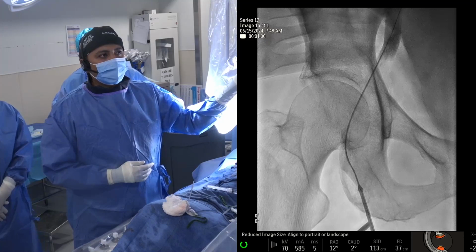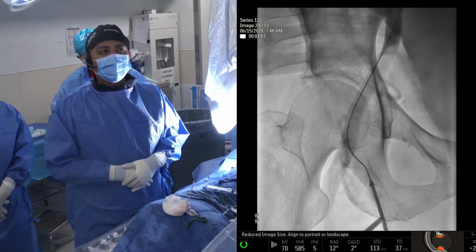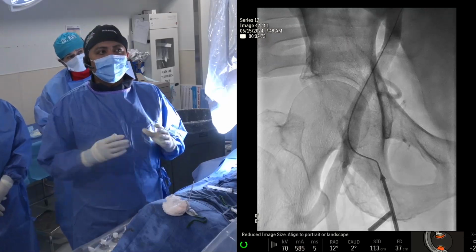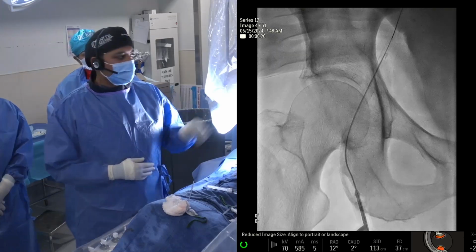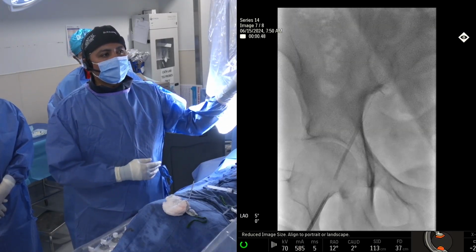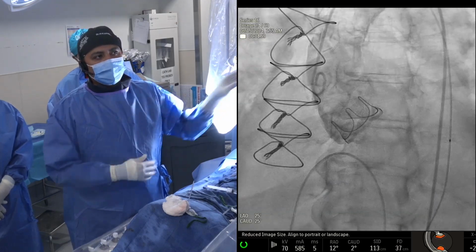And again, this was an ultrasound access, anterior stick. Like we can see here, the CFA is super long. So it would have been a beautiful case for an ipsilateral access if it was not for the adiposity and the inability to reach the closure for the distal CFA access. But you can see here, there's an ultrasound guided center stick, no calcium. And this is another one that's proving that we were actually in the true lumen. And with that, this is the aortogram.